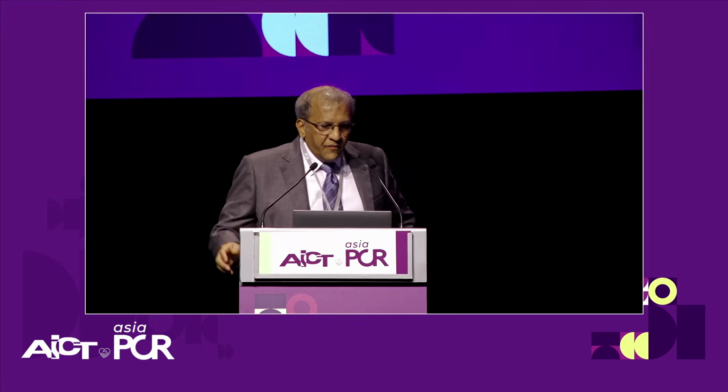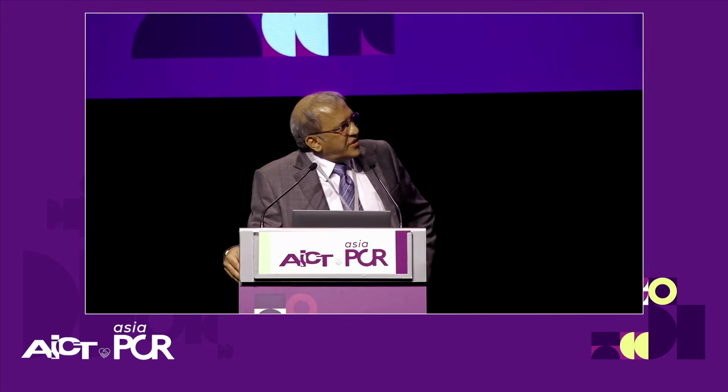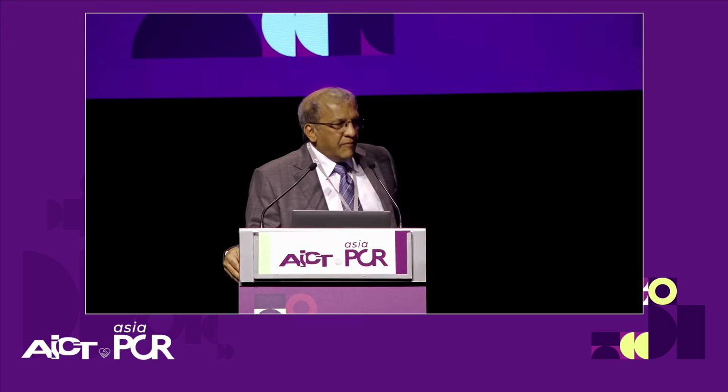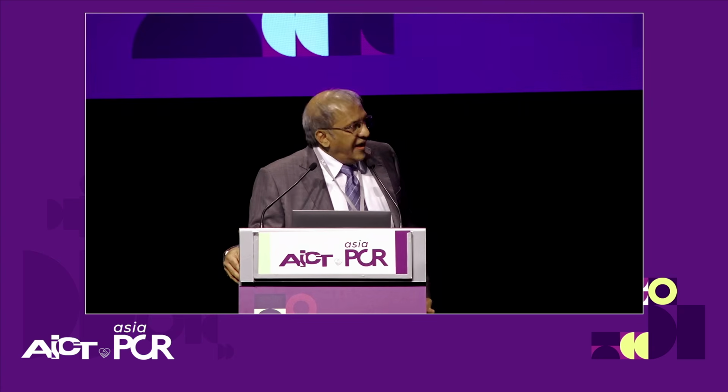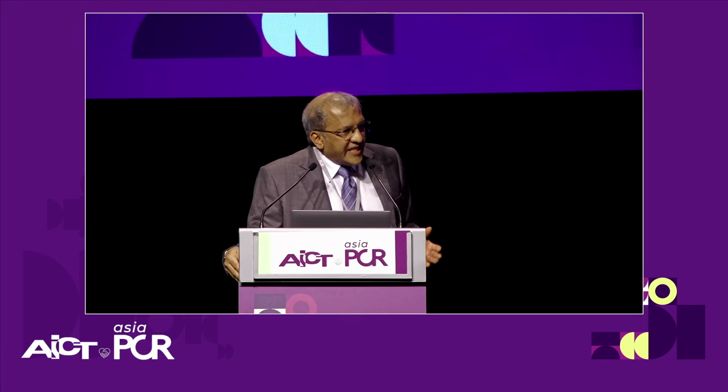Yeah. Just angiographic? Would I use IVL without imaging? I don't see the point, really. Cost cannot be an issue, because you're already using a very expensive tool. And when you're using a very expensive tool, it is also okay to use a less expensive imaging guidance to make sure that you've used that tool appropriately, effectively, and got the desired result at the end.